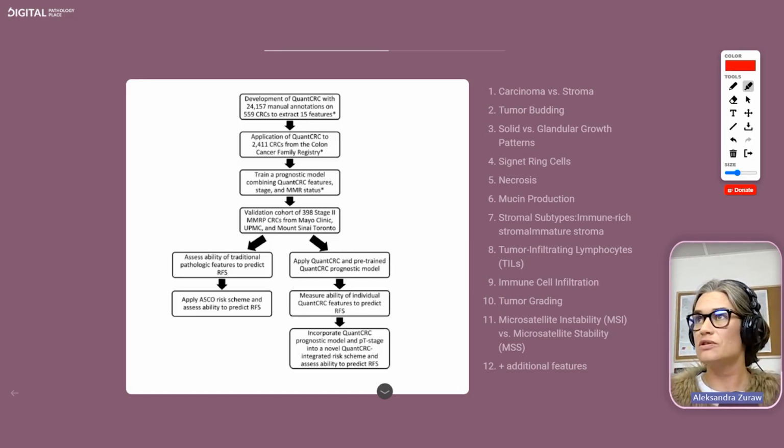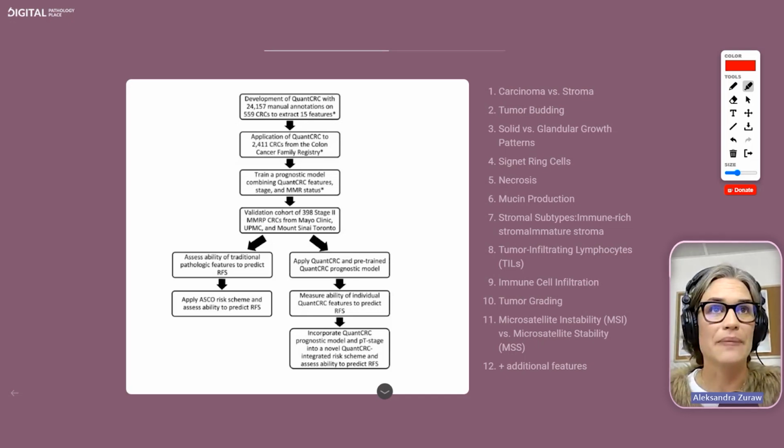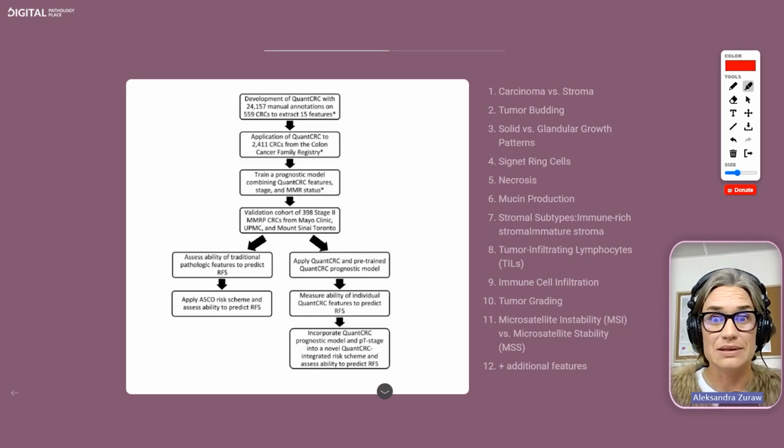And the thresholds for all those companion diagnostics, for example for PD-L1 scoring, are 10%, and this is beyond visual perception. So I would not do it. I'm not in charge of anything. This is just my personal opinion. Whenever there is counting involved, I would not make people do it. I would make computers do it.